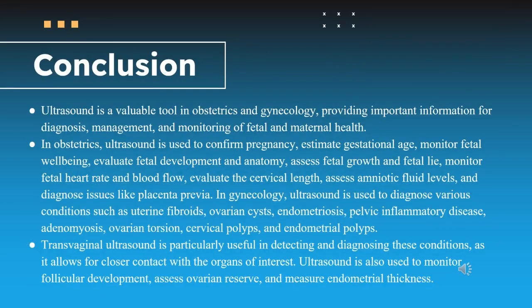So in conclusion, ultrasound is a valuable tool in obstetrics and gynecology, providing important information for diagnosis, management, and monitoring of fetal and maternal health. In obstetrics, ultrasound is used to confirm pregnancy, estimate gestational age, monitor fetal well-being, evaluate fetal development and anatomy, assess fetal growth and fetal lie, monitor fetal heart rate and blood flow, evaluate the cervical length, assess amniotic fluid levels, and diagnose issues like placenta previa.